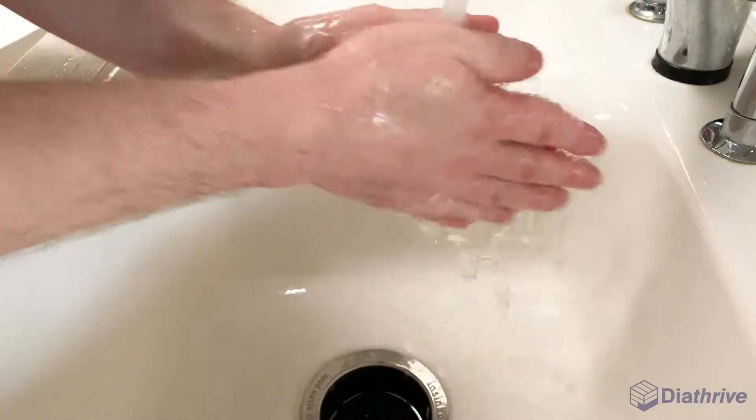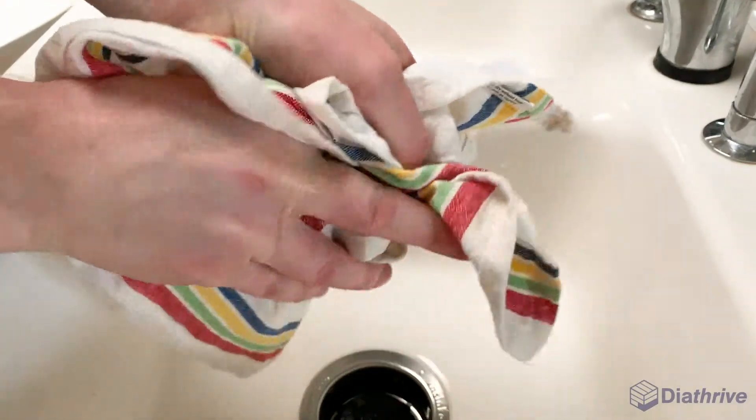Step 1: Wash and dry your hands thoroughly. This will prevent contamination of the blood you are testing.